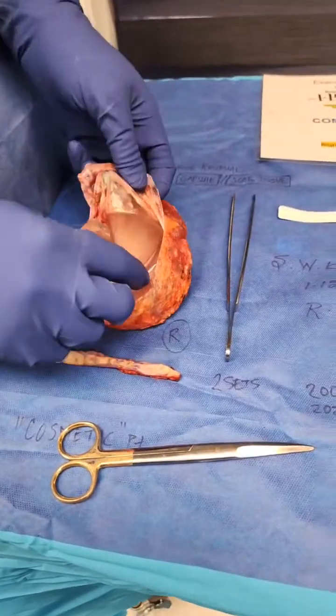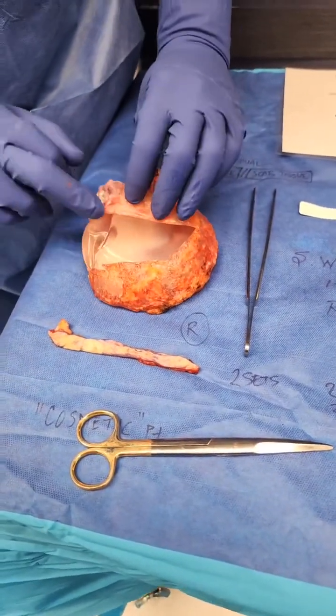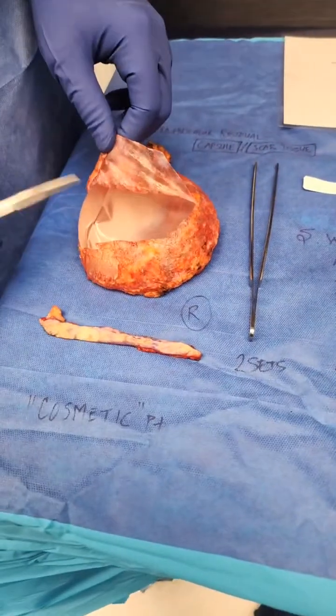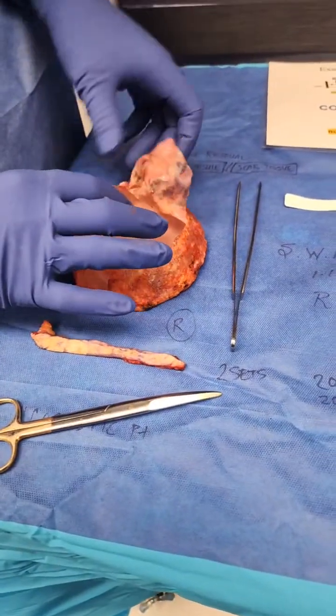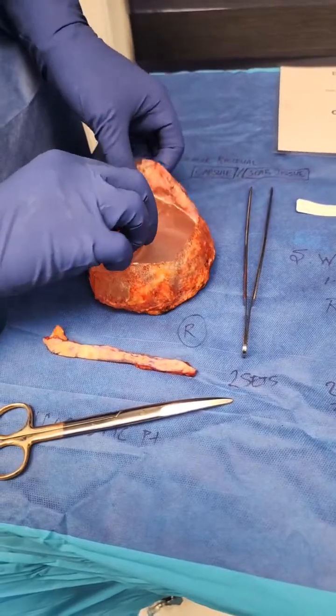And so as I cut this open, intact implant, look at the way it's compressed. See, so small amount of fluid on the inside. You see how it's compressed? Now let me go ahead and try to cut it out so you can see. So she has a capsular contracture on this side. You can see how it's sitting bunched up on itself. And you can see again, look how thin this capsular tissue is.